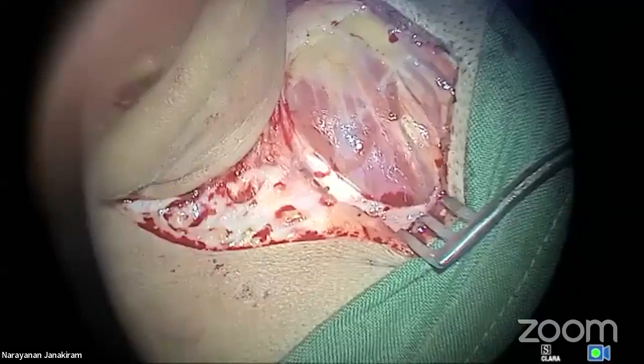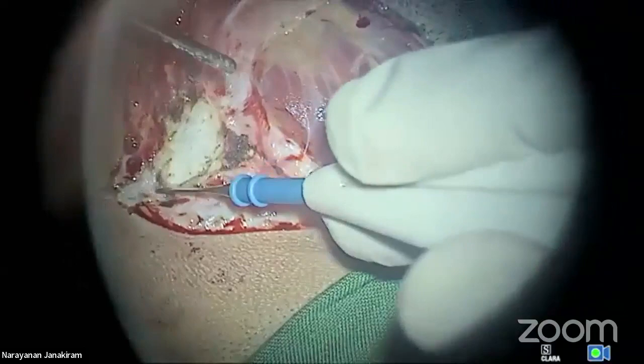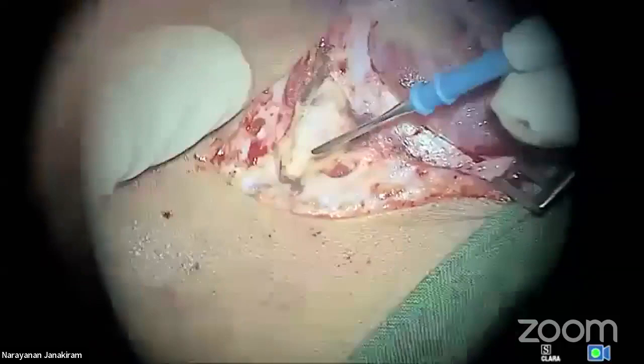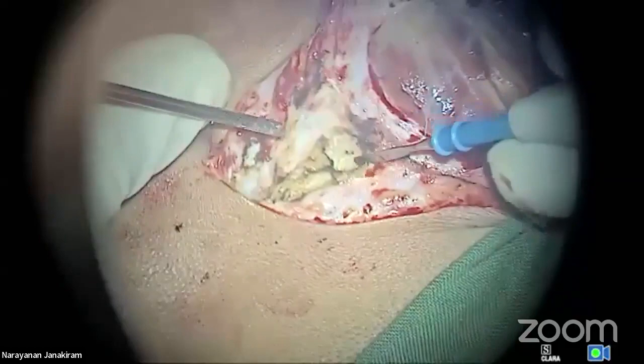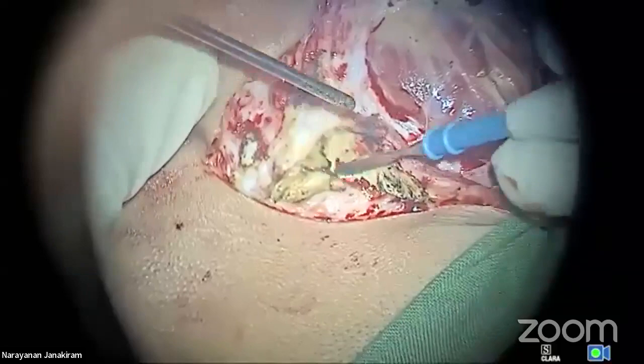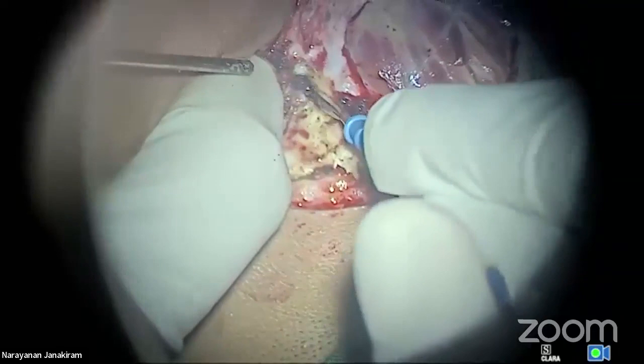Step two is exposure. Now see here, I start with exposure here. Almost completely bloodless. You can see here. Now you palpate. And then the kind of reconstruction you want to do, you can plan. See, that's the vessel. Go just behind the vessel so that you don't have a bleed here. This is the vessel from the floor of the temporalis muscle. Now you'll find fat here. Yeah, you'll find fat here. Go along that fat. Very, very important, my dear friends. Or else you will have the bleeding there.